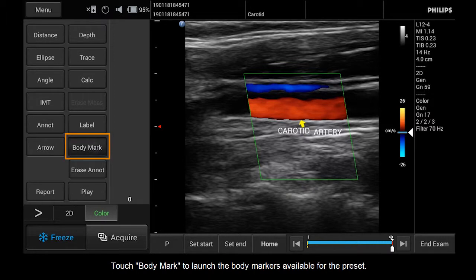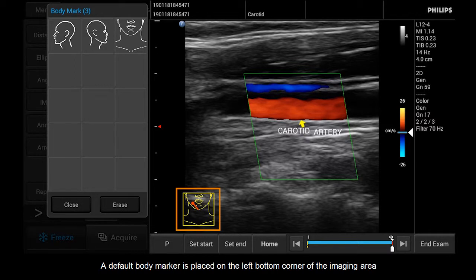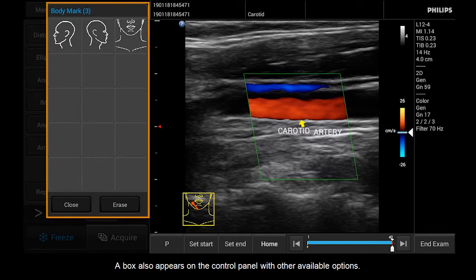Touch Body Mark to launch the body markers available for the preset. A default body marker is placed on the left bottom corner of the imaging area. A box also appears on the control panel with other available options.